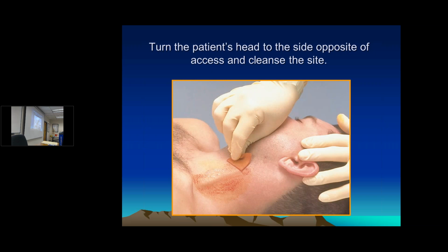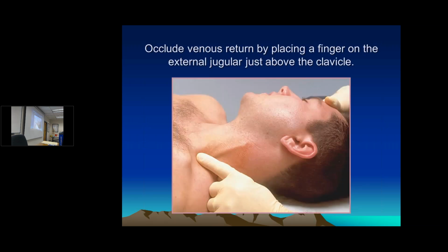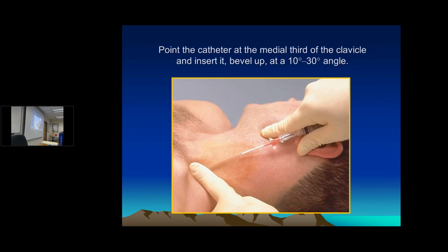So we're cleaning it. The one other difference is that what he's doing, he's just tamping out below, so that, remember, blood is coming back to the heart in this direction right here. So he's just tamping out below, so this will kind of stand up for you. And the other difference is that we're going to come in this direction, back towards the heart, not going up in the opposite direction. You do want to be careful in terms of that. You already told me about the possibility of air, but using good technique, it's a primary place where you use it.